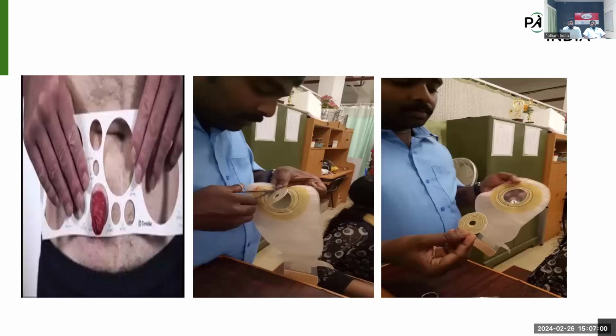So this one is the actual picture you can see. First picture you can see on gauge. This one is the measuring gauge. This measuring gauge you can get along with the colostomy bag and set. This gauge has different size circles, for example 25 millimeter, 35 millimeter, 40 millimeter, like that.